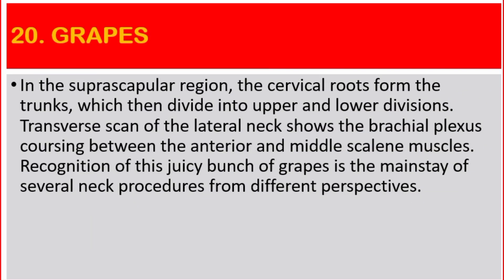Number 20: Bunch of Grapes. The cervical roots form the trunks, which then divide into upper and lower divisions. Transverse scan of the lateral neck shows the brachial plexus coursing between the anterior and the middle scalene muscles. Recognition of this bunch of grapes is the mainstay of brachial plexus neck procedures from different perspectives.